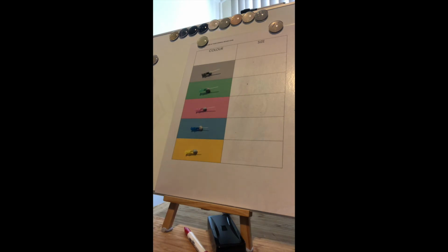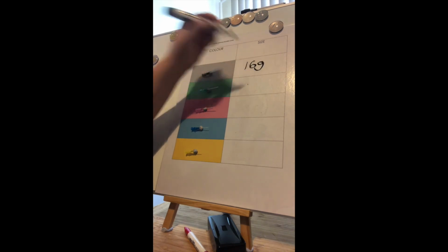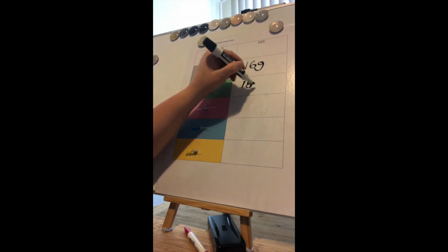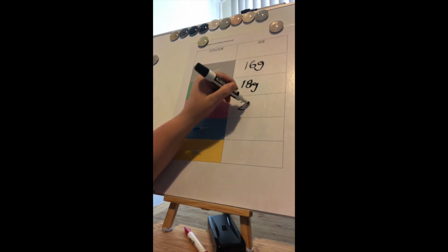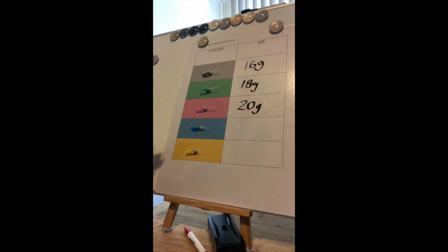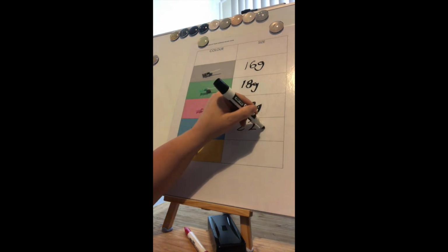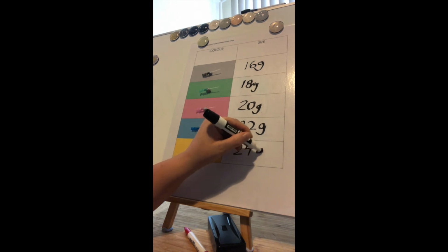Okay, the final part of the activity is just to help you put all of this together. We've got a chart here showing our colour and sizes of cannulas. We'll start with our biggest cannula, which is grey, and it's 16 gauge. Then we move down a size to our 18 gauge green cannula, then down to our pink 20 gauge cannula, getting to our smaller cannulas now, our blue 22 gauge cannula, and our baby, the 24 gauge yellow cannula.